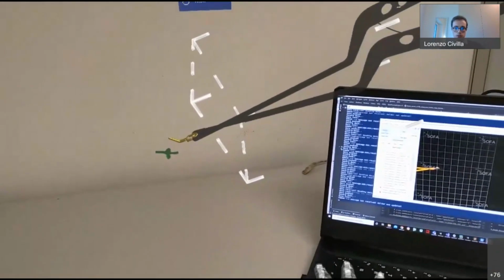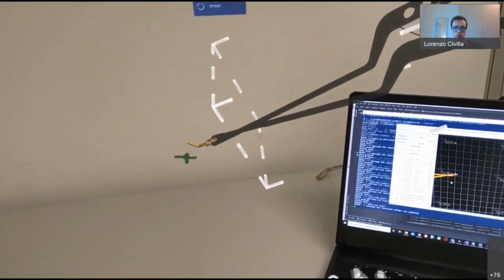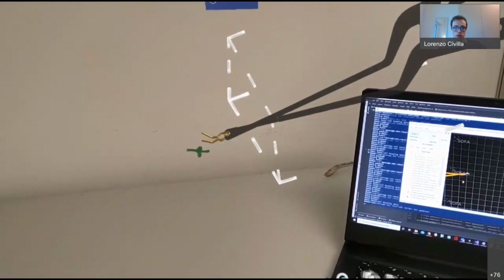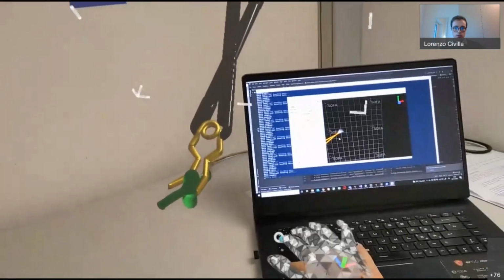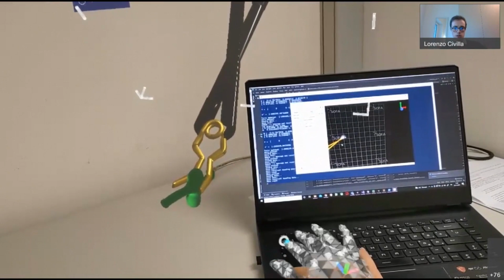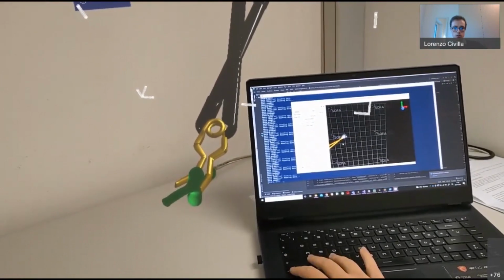The holder is placed in position. The clip is opened with a keyboard control to reach the desired aperture, and once repositioned in the desired configuration, the clip is slowly closed and the aneurysm is deformed accordingly.